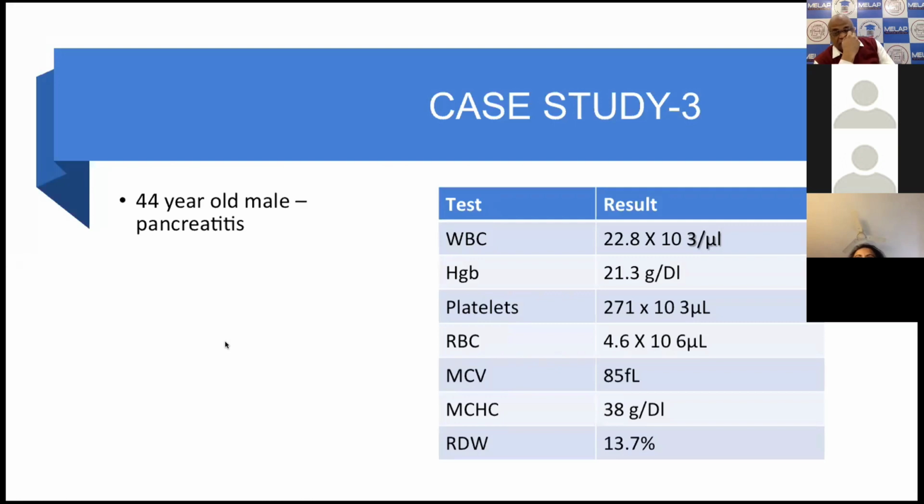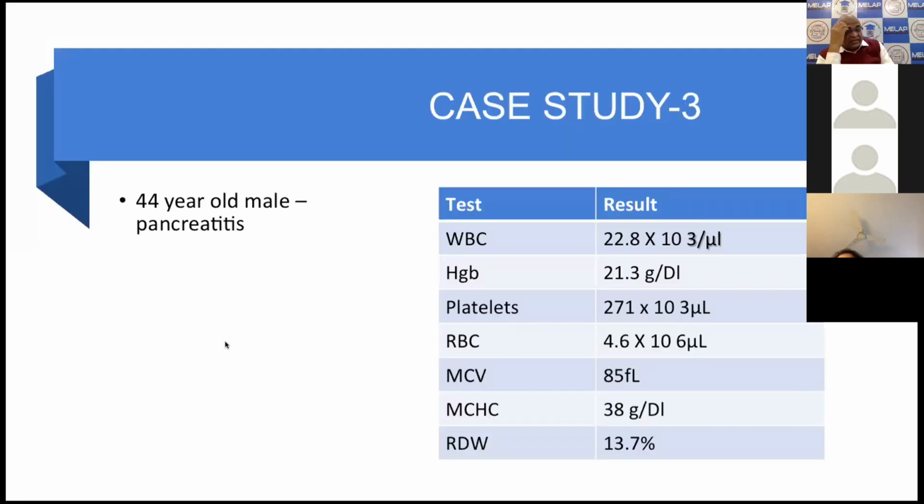Now see, in this, hemoglobin is very high, TLC is very high, MCV is normal. They thought this is some myeloproliferative disorder, and they were planning for bone marrow. But what was the reason? In this case, the serum was lipemic, and lipemia was causing pseudoleukocytosis and a pseudo increase in the hemoglobin. That is why I am saying these pre-examination requirements are very important.